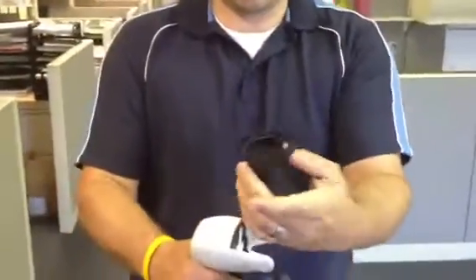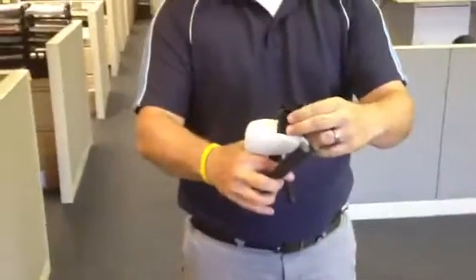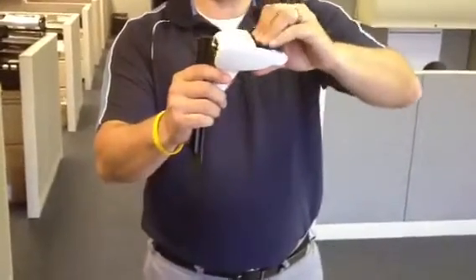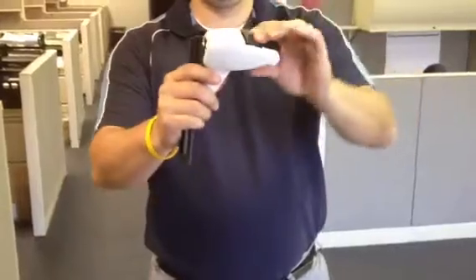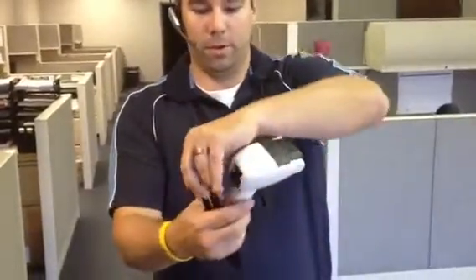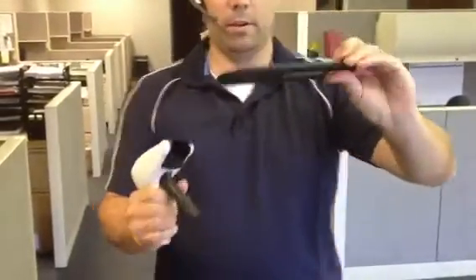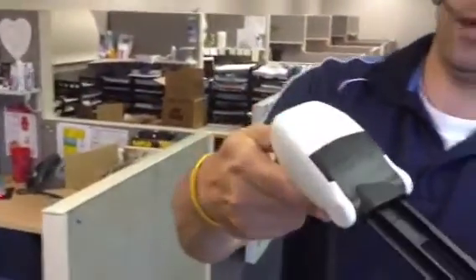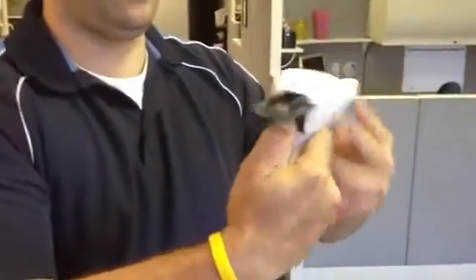So we just take the top part, flat side up, and stick it in there. You might have to kind of wedge it in there just a little bit like that. Once you put it in there, slide it in towards like that. Now once you've got that in, there's a little button on the back. Take this little piece right here, put the grooves up — it's got a little spot where it slides in. It can't go in unless you push this on the back, and it'll slide there.